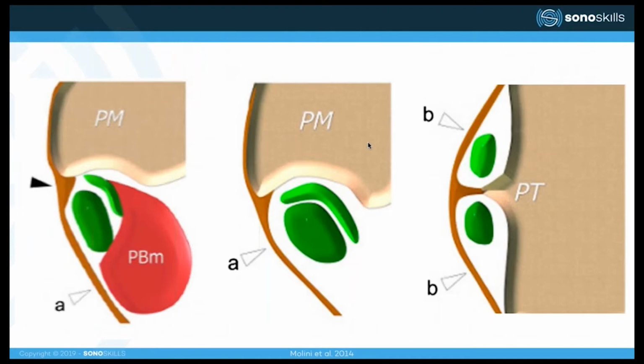So let's start at the dorsal side of the lateral malleolus. The peroneus brevis has quite a long muscle belly. The tendon of the longus is already tendinous. And in the middle image, if you go slightly deeper, you can already see that they are both tendinous. The bigger one is the longus. The longer but thinner one is the brevis. And the brevis is closer to the bone. I will say a little bit more about that later.